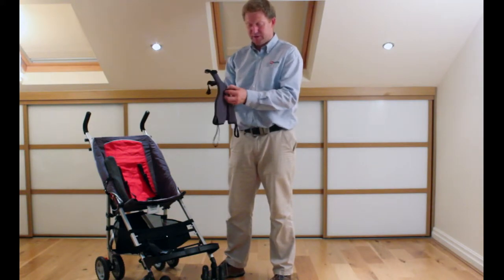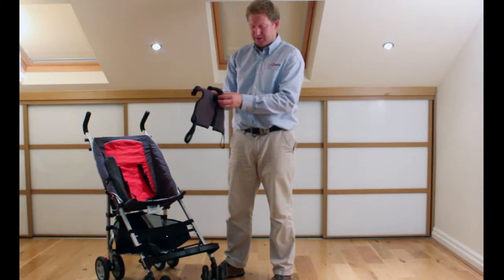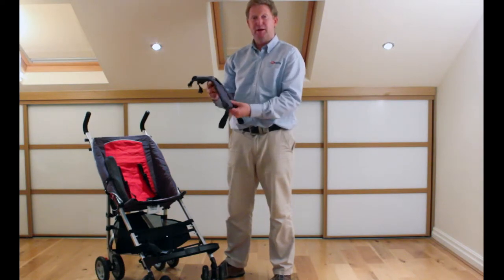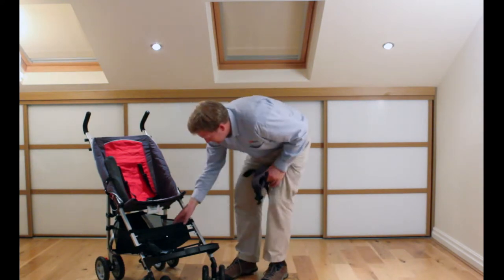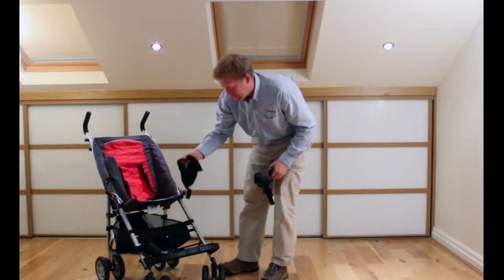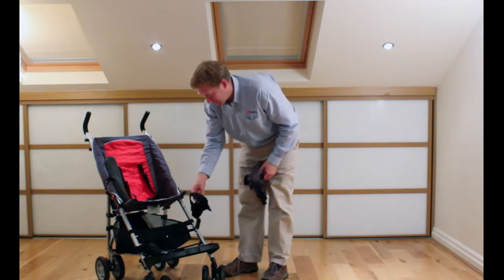It's got a velcro piece on here so that they can't get access to the zip and undo it and try to get out. And then there's the ankle huggers.